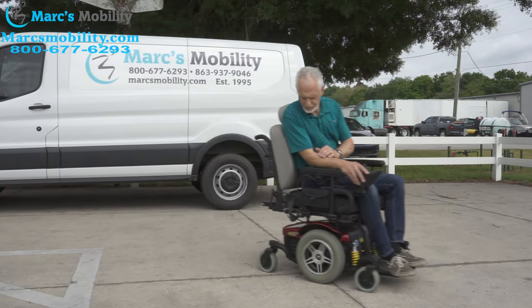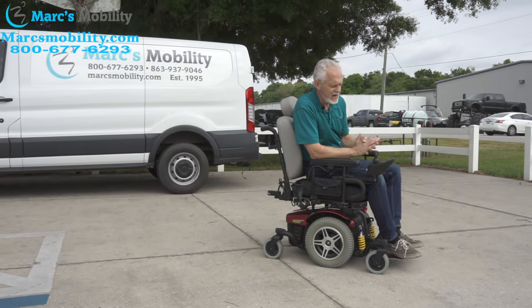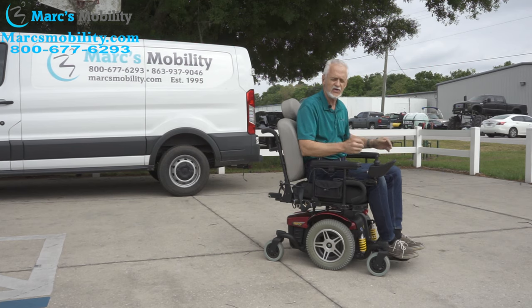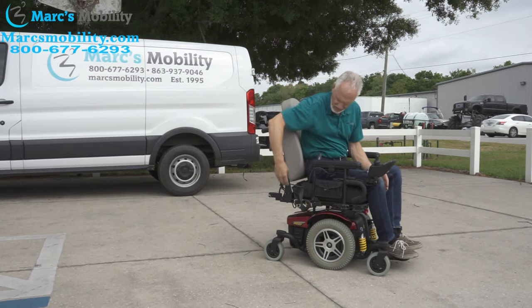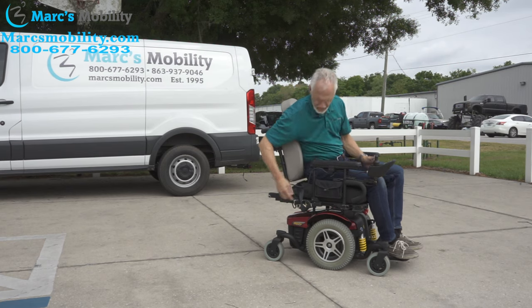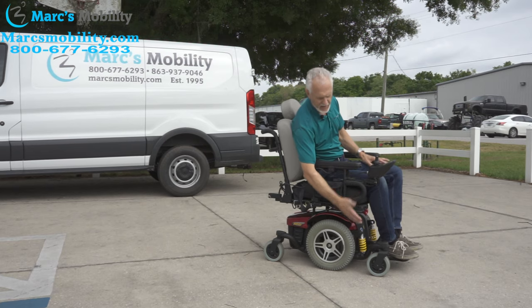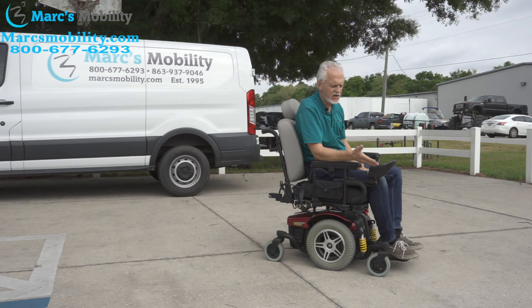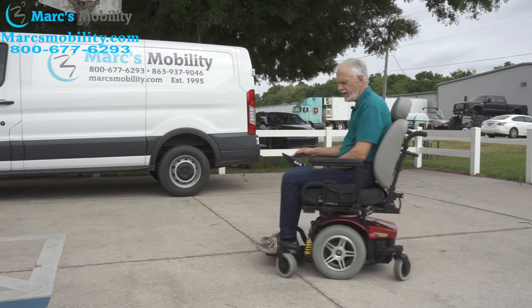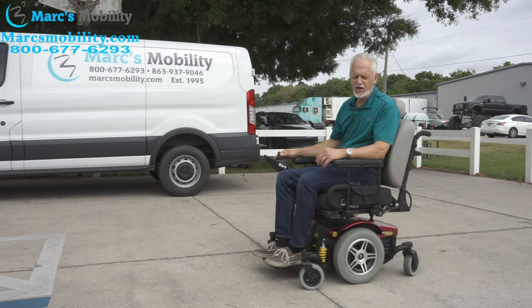Again, the Jazzy 614 HD has a 450-pound weight capability and a 22-inch seat. Everything is adjustable — if the back is too straight, it can be tilted back. It can also be tipped from the bottom for more seat positioning. Top speed is five miles per hour, and it turns on its own length. This is the 614 HD by Pride Mobility.